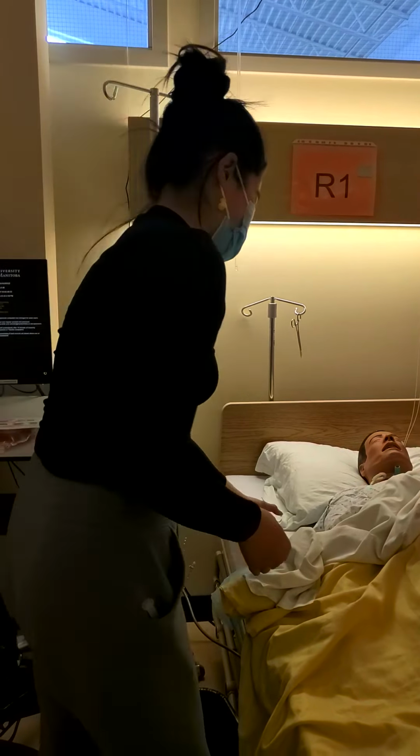And now we're going to submerge this valve with the normal saline, so when the blood goes through and we prime the blood, that it doesn't hemolyze. And then I'll prime my tubing. I'll make sure to maintain sterility. So I'll open this up. Yep, coming.